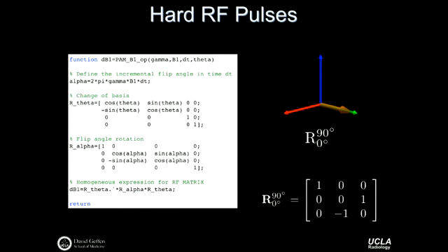By convention, that means think about a B1 field that's oriented along the x-axis, meaning you can think of it as the current running down my x-axis, and I'm going to generate this left-handed field through the x-axis. If I go to 15 degrees, I'm going to rotate away from x towards y, and then through 45, 60, and eventually 90 degrees. Then 90 degrees will have my thumb pointing along the y-axis.